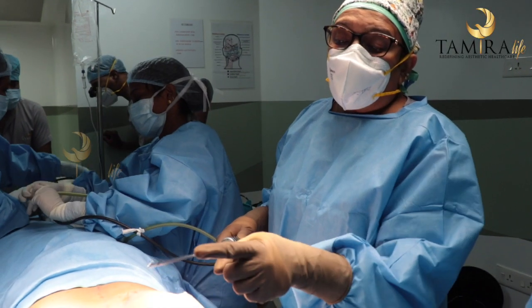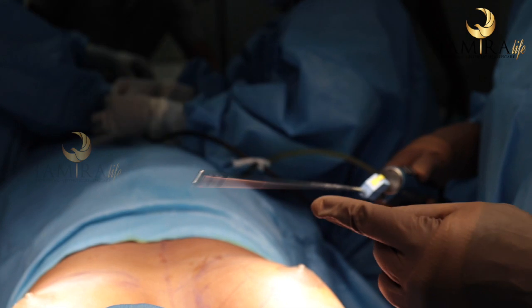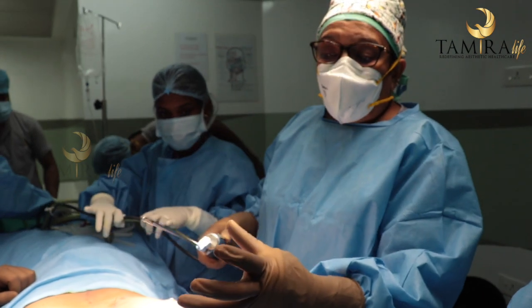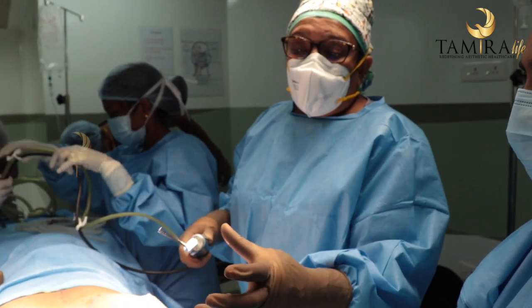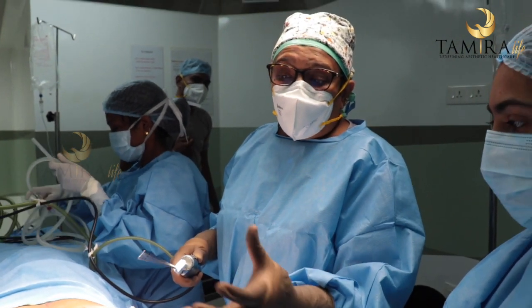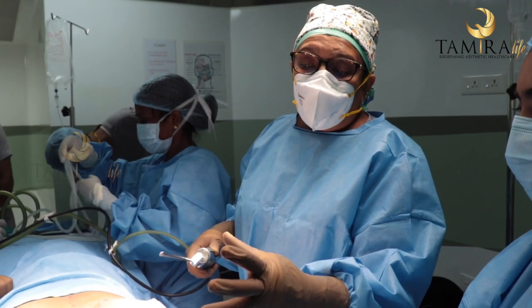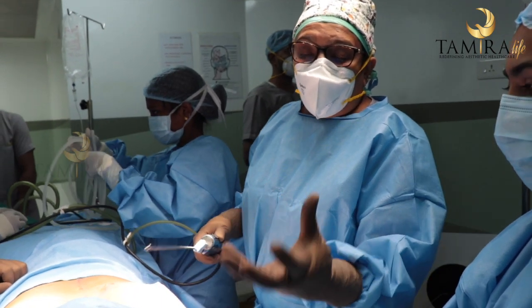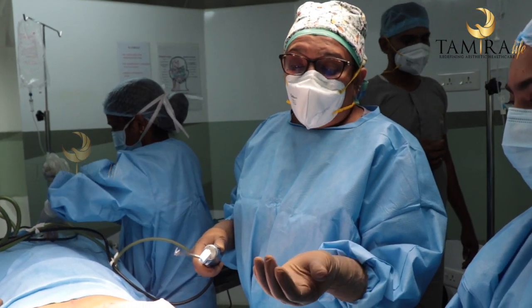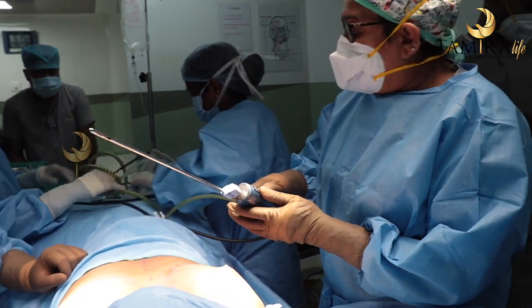With the vibration here, you see the cannula moves up and down, as well as forward and backward. Now in many places they do liposuction without this vibration. The advantage of using this is that with minimal time, more fat is sucked out and there is less trauma to the tissues, because you don't force, it automatically grinds. The amount of vibration can also be altered depending on how much fat we want to remove and the thickness of the fat pad. So this is called power assisted liposuction, and that is what we will be using today.